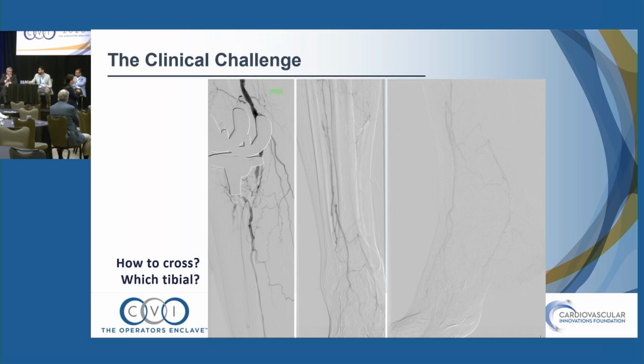Would you start with an ipsilateral approach or contralateral approach to your sheath? This is actually the trade-off of not getting a preceding CTA. I love living on my toes, so I almost never get a preceding CTA. But you also run into the issue where there is no pre-procedural planning, so I was up and over from the other side. So do you get duplex? I did not. Not routinely.